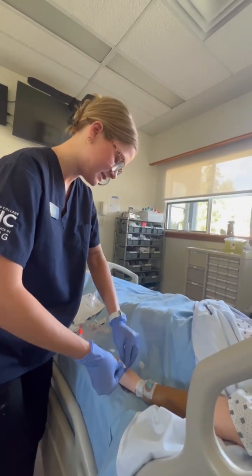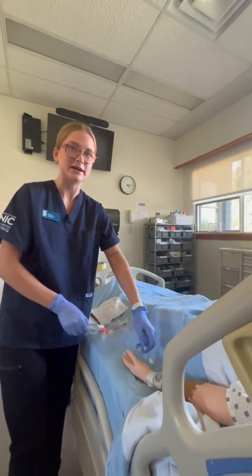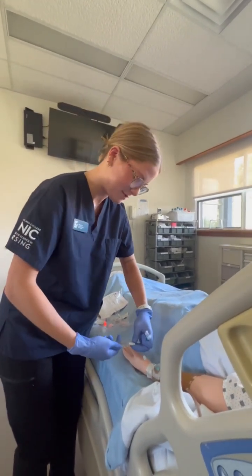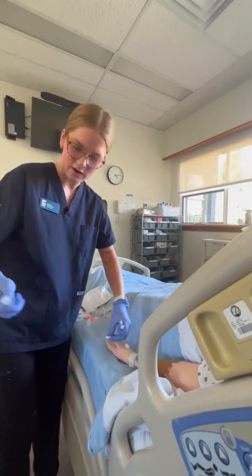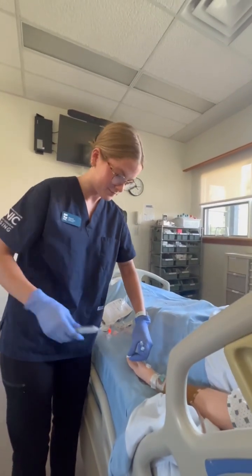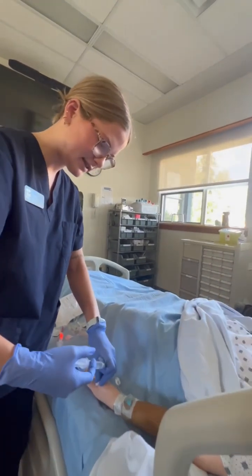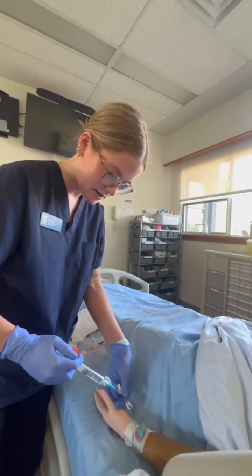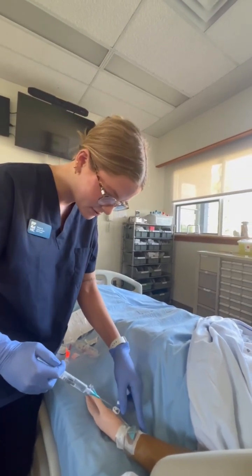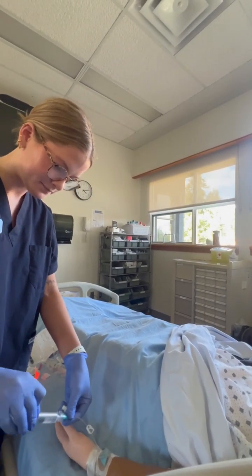For timely reasons for the video, it won't be 30 seconds and letting it dry, but I would do that in normal practice. This is also sterile now with the tip, so I would just let the air out. And I'm going to assess the IV site as I infuse at least 3 milliliters of normal saline just to ensure patency. And the IV site looks good.